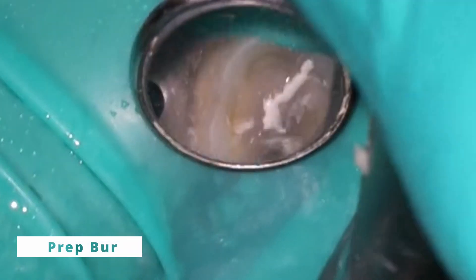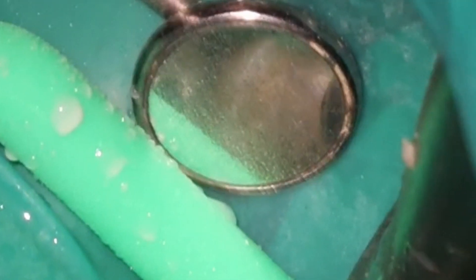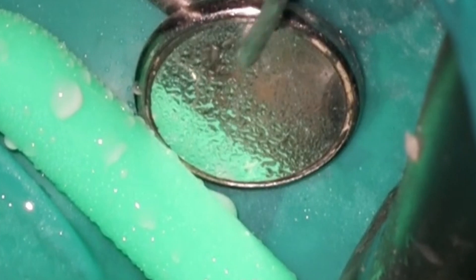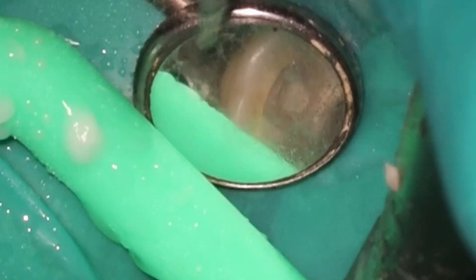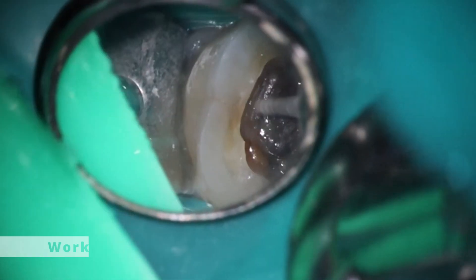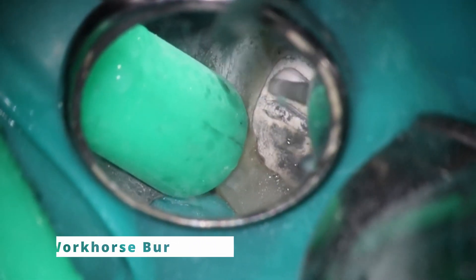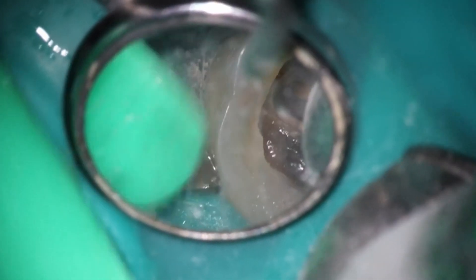Then we're going to be removing the composite. I'm not going to remove all of it, but I will remove more than I would need for just an access, so I can see how bad the crack is. Sometimes on that mesial marginal ridge it's not too terrible, but you remove the composite and all of a sudden you see it's completely through the tooth — the tooth is split in half. Thankfully here it really wasn't that bad. You can see the staining; I'm assuming there was an amalgam in this at one point based on the color and the fact that it has a fracture. The crack was pretty shallow — it didn't even drop down inside the chamber. Still not sure how bacteria got inside there, but this thing was definitely dead. There's no doubt about that. It did need the root canal.